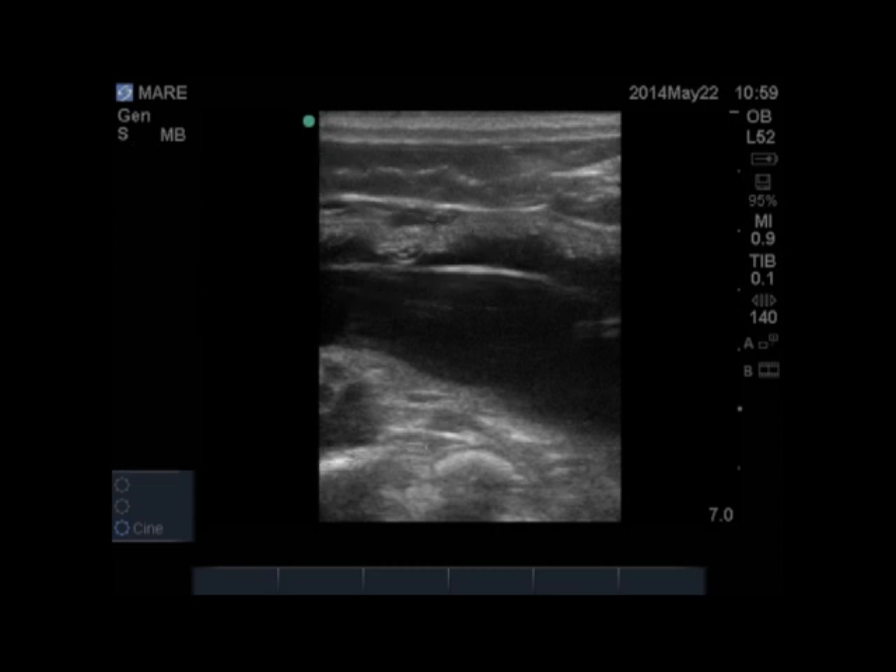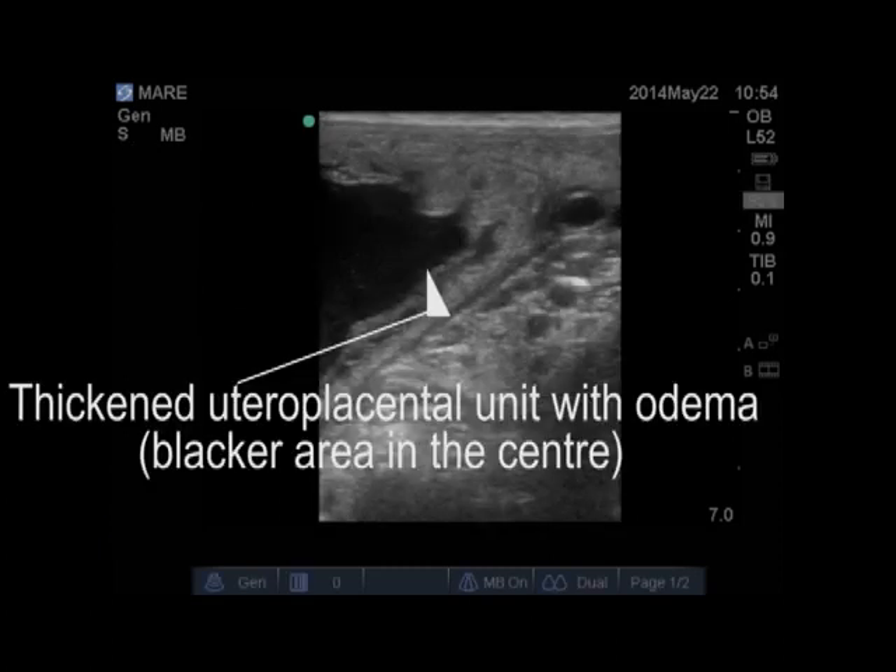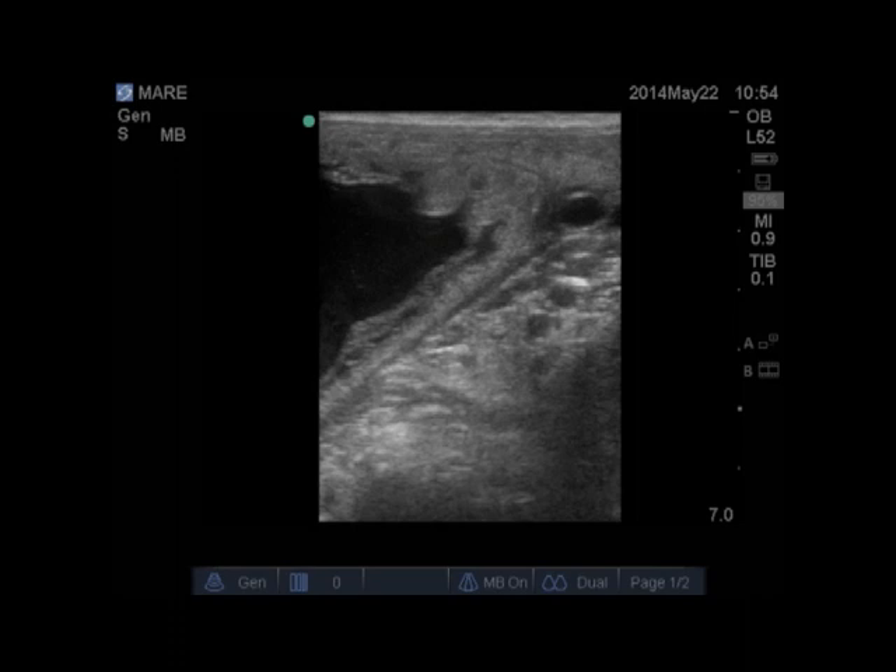The next image we have is just of a mare that has a slight bit of placentitis. You can see the thickening compared to the normal utero-placental unit, and the black area is edema, which shows it's just a little unhappy. So this mare will go on antibiotic and progesterone treatment, but hopefully she should carry fine to term.